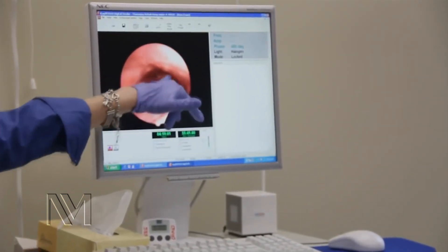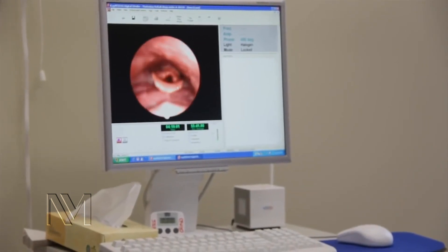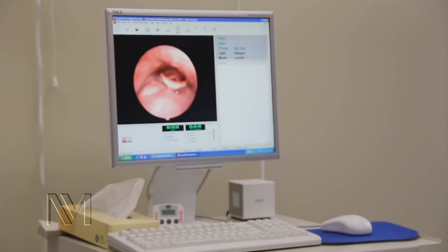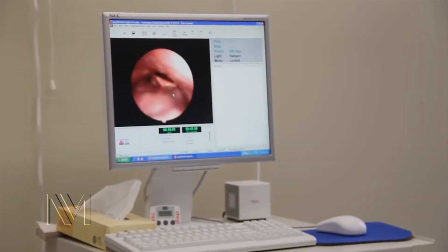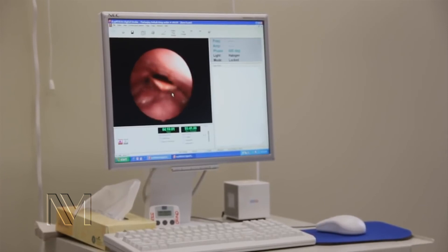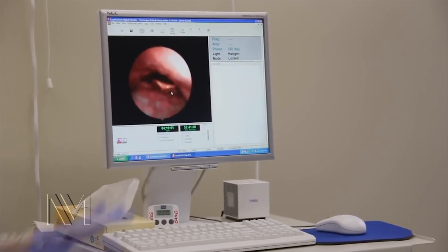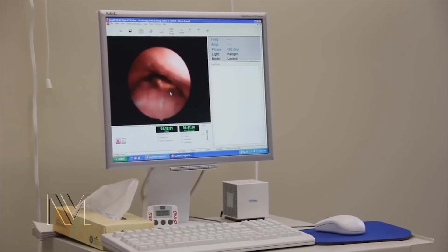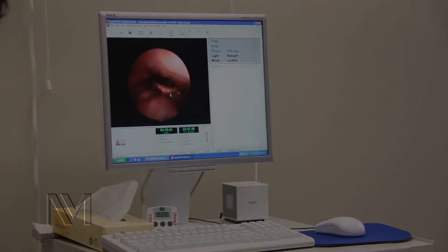A bit of carrot, so we can assess some crunchier food. Chewing phase again, and a look from above through the larynx. Good. Timely swallow. Everything's cleared. Piecemeal deglutition, so continued chewing would be appropriate.